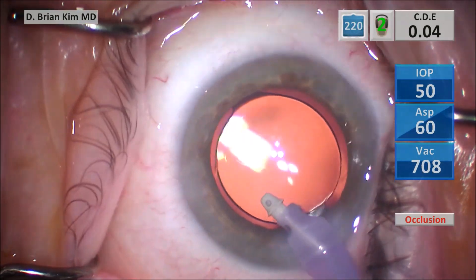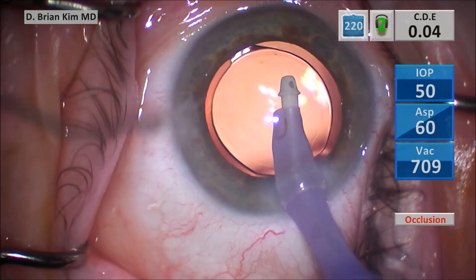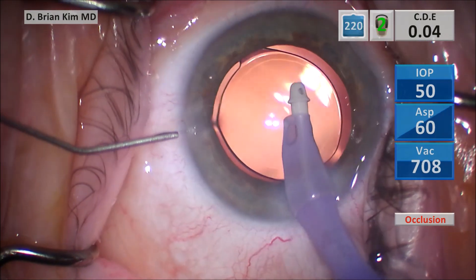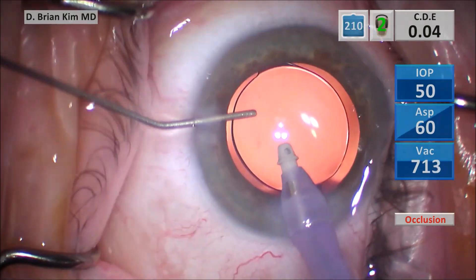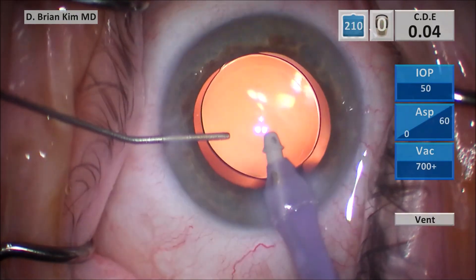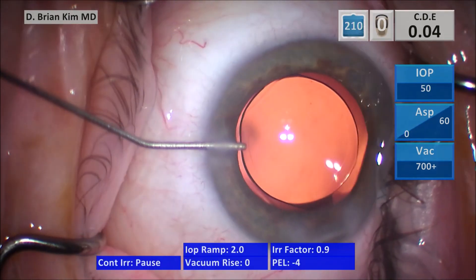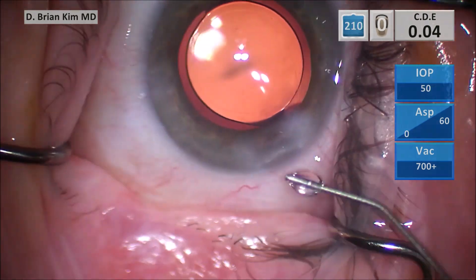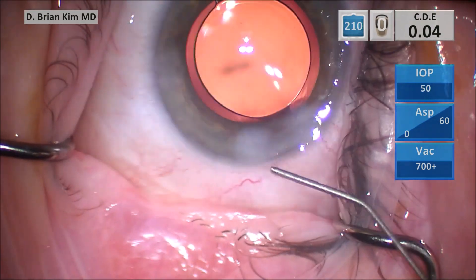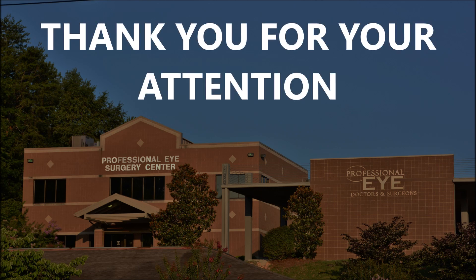Then I hydrate my incisions. You can see this patient had a really strong Bell's reflex, which turned the eye up. It's very hard to do the maneuvers when the eye is not straight. Using a two-handed technique in an atraumatic way — by using a cotton tip at the beginning of the case and then using the cannula within the incision — allows me excellent control. I'm not using forceps, because if you use forceps, you can accidentally rip the tissue if the patient suddenly jerks against you. I hope this was helpful to you, and I thank you for your attention.